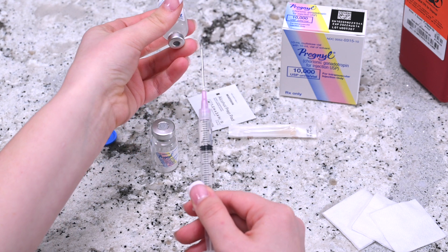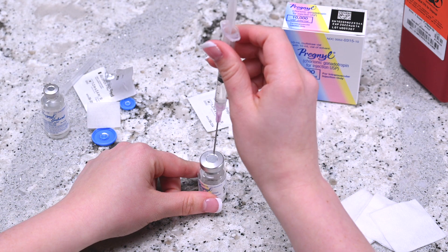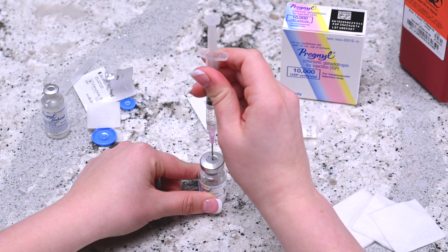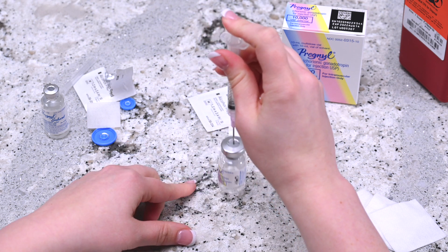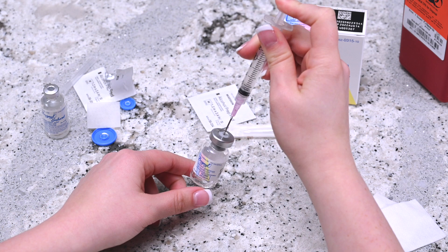Keep the tip of the needle immersed in the solvent by moving the needle down as you draw the medication. Remove the needle from the vial and place it into the vial of Pregnol powder and release the solvent by pushing the plunger. Mix the content of the vial by gently swirling the vial until all the powder has been dissolved.